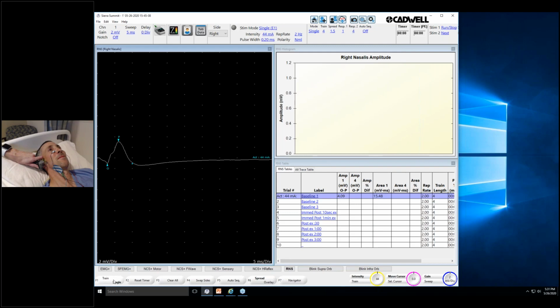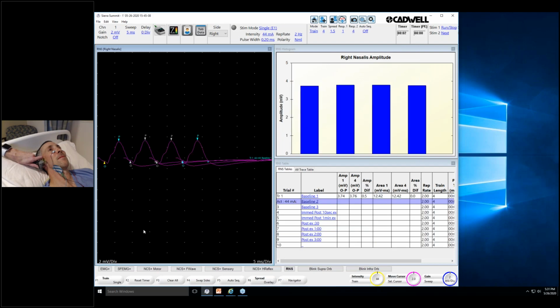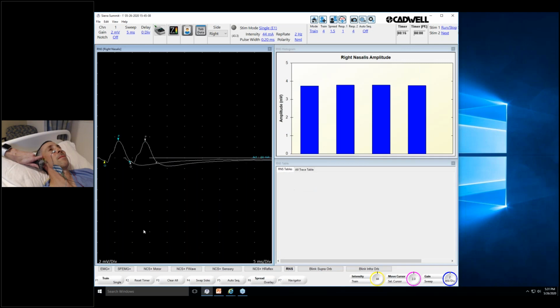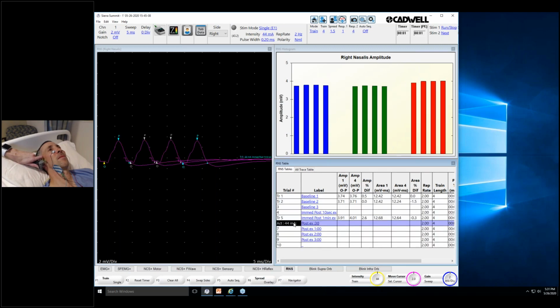Okay, so we're going to give 4 shocks here. And they look good. 0.5% actually increase. Here comes another 4. Zero. And then I'll exercise. So to exercise, we have them scrunch their face up. Here they come. So it went up a little bit, 3.9.